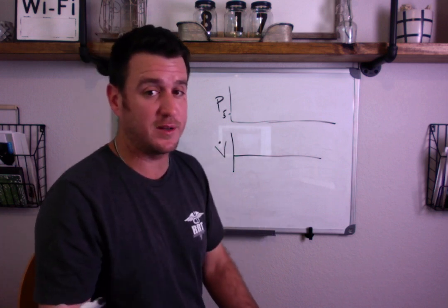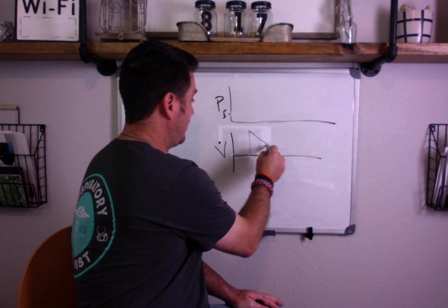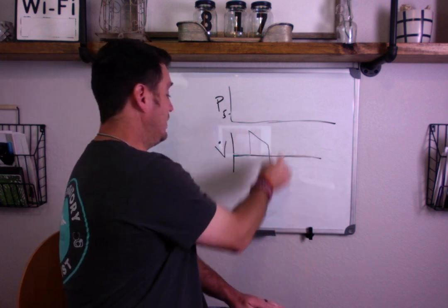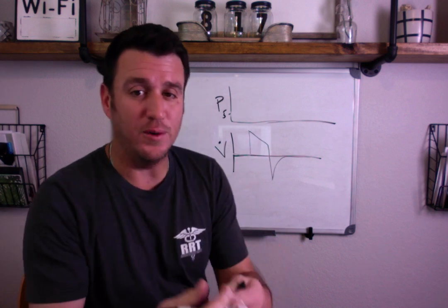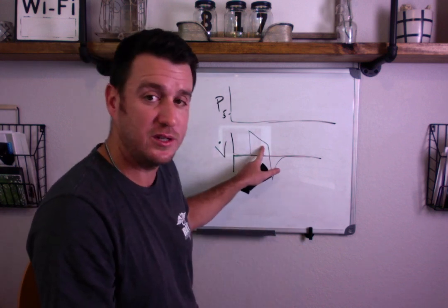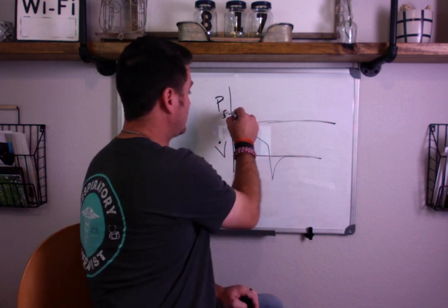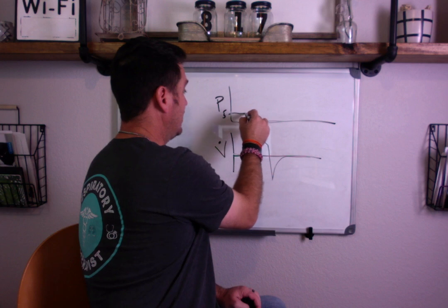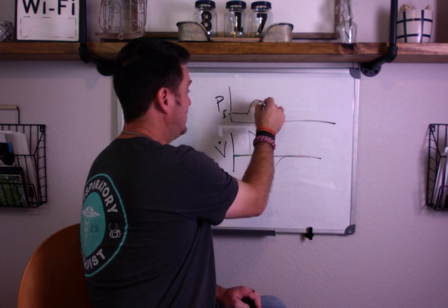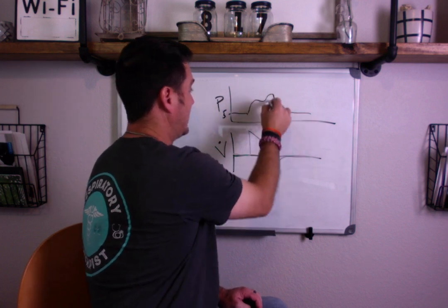So after the breath starts, you see this very slow, you see this anomaly on your pressure waveform. Now remember, we're in volume control. So the breath comes in, it comes up, and it gives, right? Now, in volume control, flow is set. So if flow is set, then this isn't going to change. So what's going to change is going to be what you see on your pressure manometer. So your pressure comes, the breath starts, and then you see this dip before it falls back down.